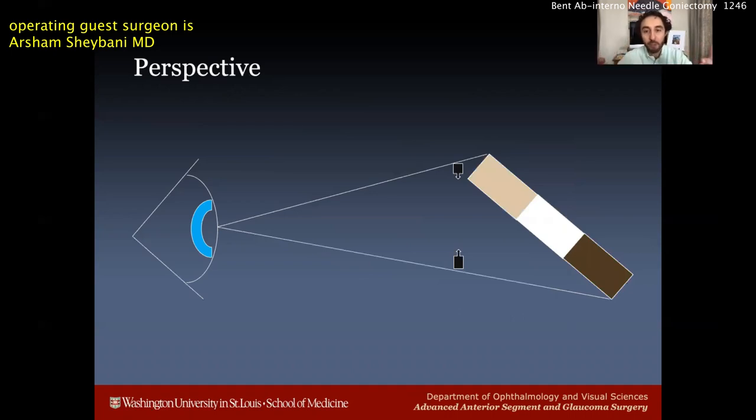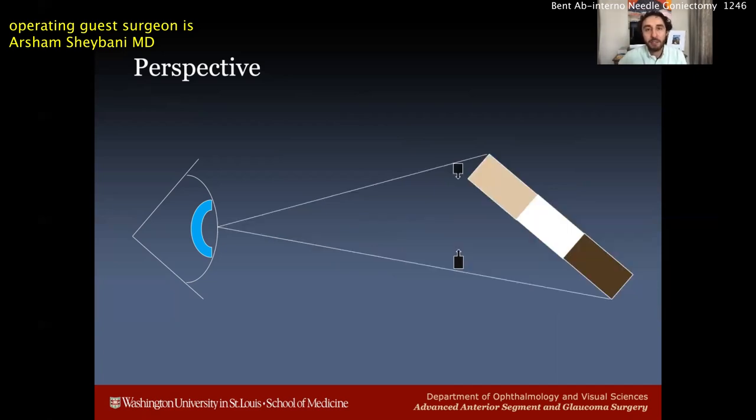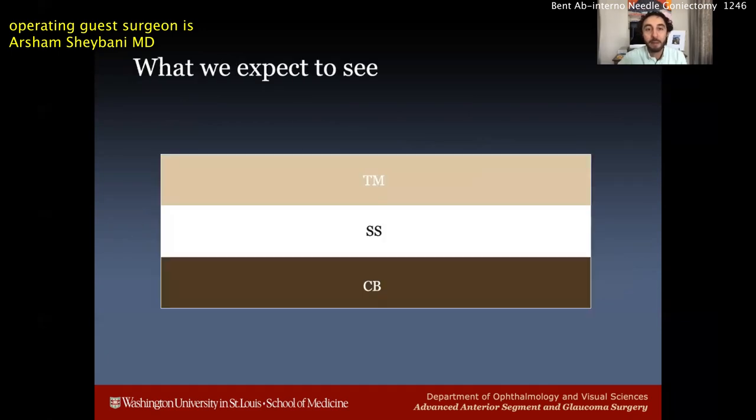If we face forward and are facing the angle exactly in line, we should see these distinct layers. But many times what happens is the patient is not turned away from us enough — the eye is turned slightly toward us, which is not ideal. As you can see, our view is reduced. The structures don't change in size or shape, but our perspective changes: they look shorter, they blend together, and this is where people can run into trouble — sometimes treating the wrong band and causing a potential cyclodialysis cleft.